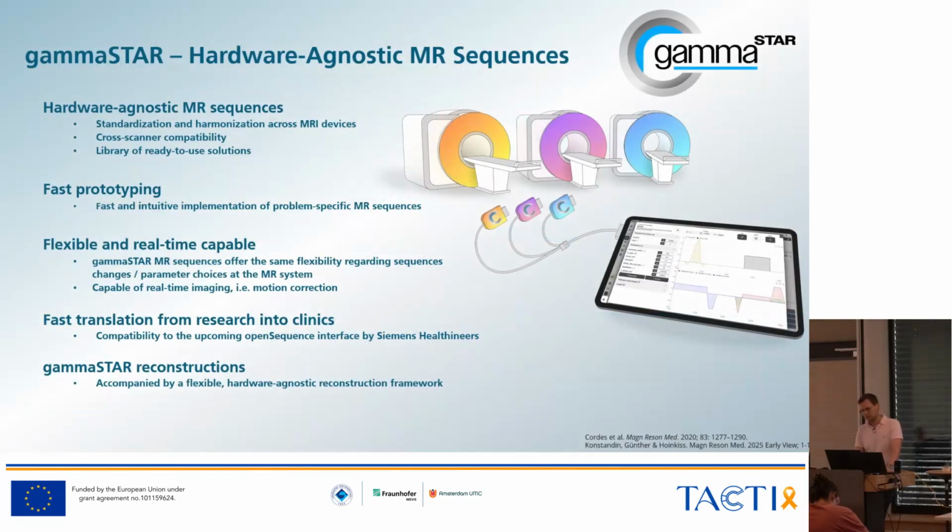So we came up with a framework that we now call gammaSTAR. And the idea is really to have a web-based intuitive front end that then, in this illustration here, has these adapters going towards the MR system, and all the hardware-specific details are really only in these little software drivers, and everything that's being implemented is in a generalized way.